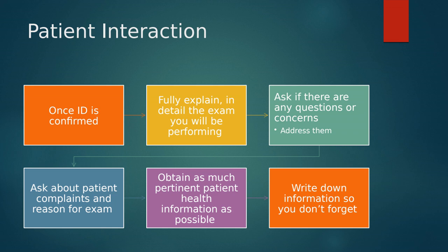We do some invasive procedures. We do some very sensitive exams. We do breast imaging. We do scrotal imaging. We do transvaginal imaging. All of these exams require very precise and effective and professional communication. If you're the patient and you see somebody coming at you with the transvaginal transducer, and no one is asking you permission, no one is telling you what's going on, no one is explaining what they're about to do to you, that is a form of assault.